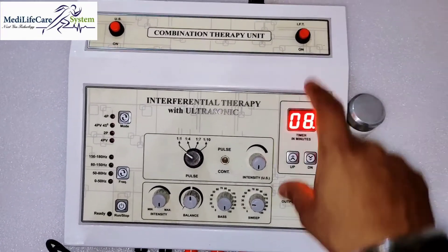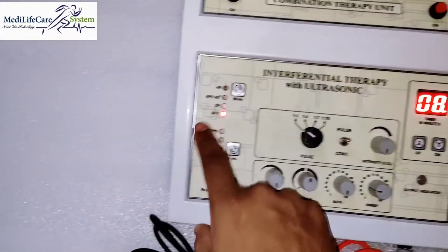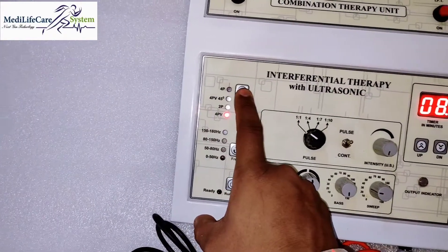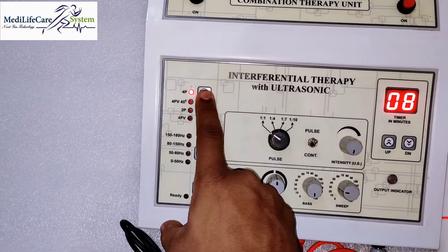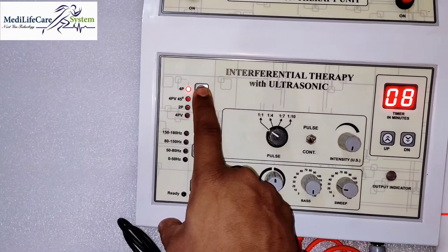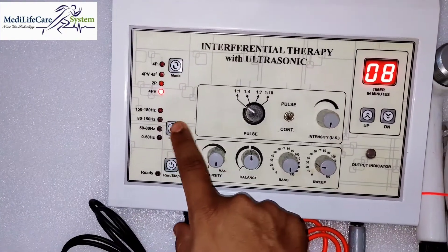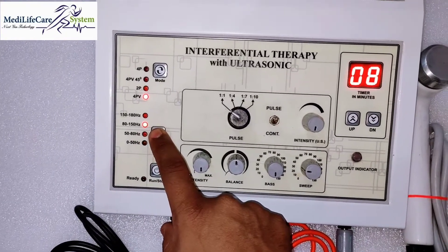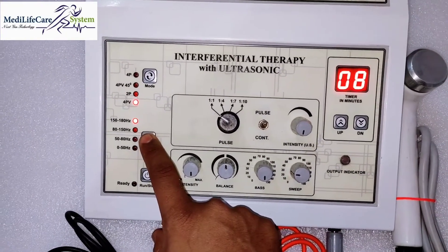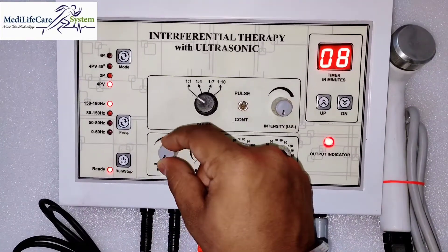If you want to start IFT, simply press this button, then change the modes from here: two-pole, four-pole vector, four-pole vector 45 degree, and four-pole. The frequency options are 0 to 50 Hz, 50 to 80 Hz, 80 to 150 Hz, and 150 to 180 Hz. This is the start button and this is the intensity control.